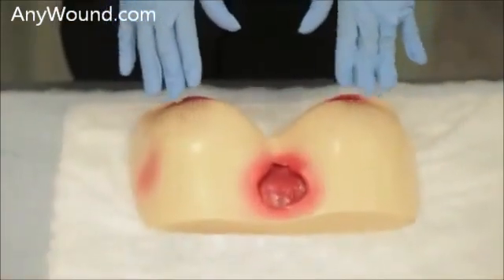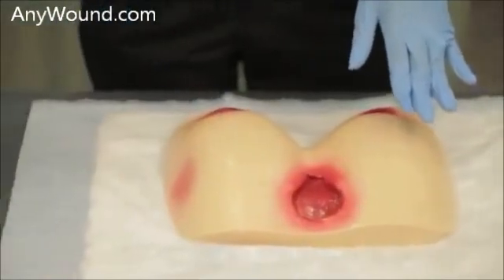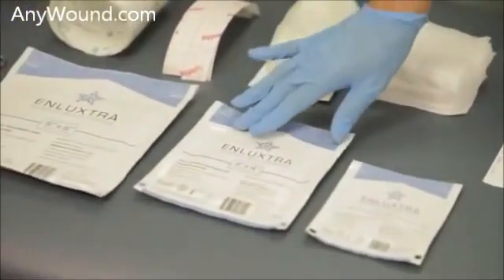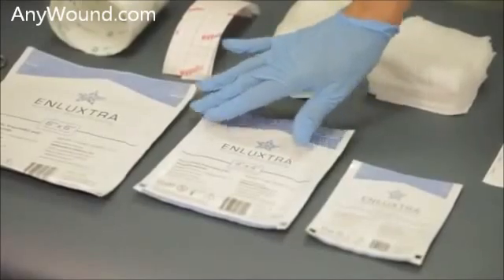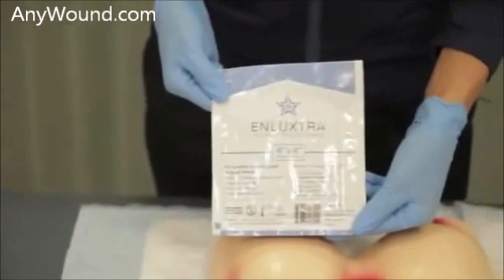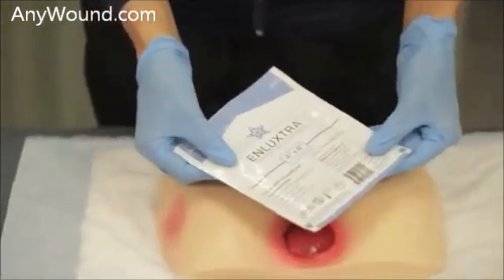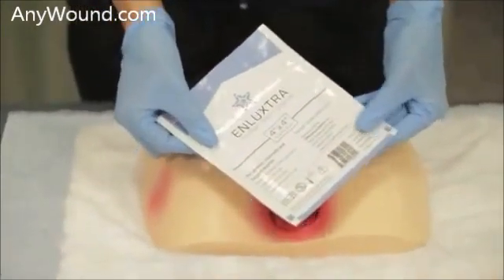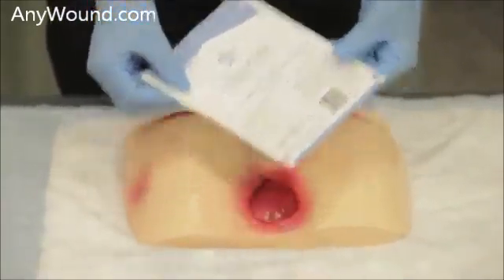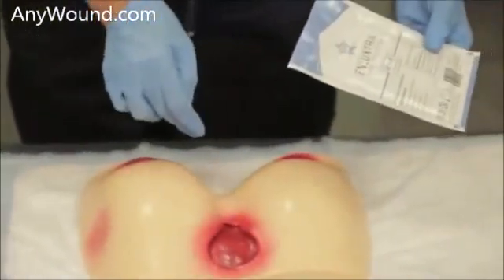The next process after preparing the wound bed is, based on your measurements, selecting the best size of Enluxtra. On this particular wound, a 4x4 would be adequate placed in a diagonal area, covering all outside borders.